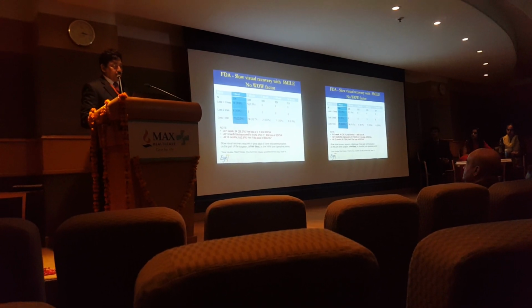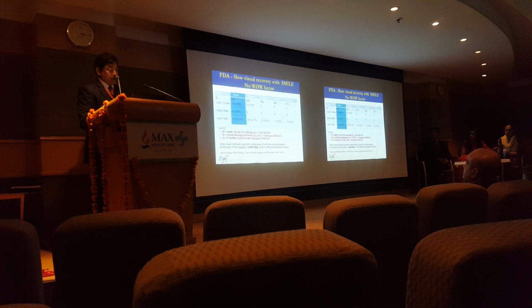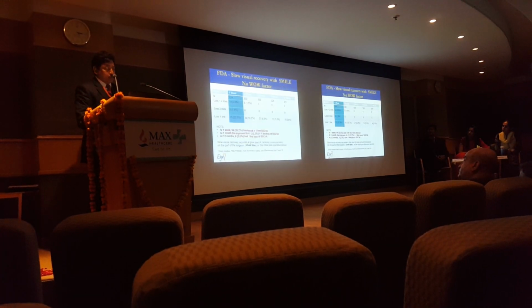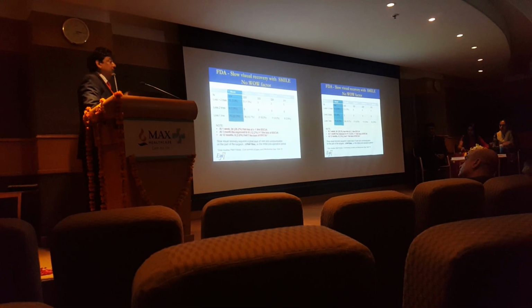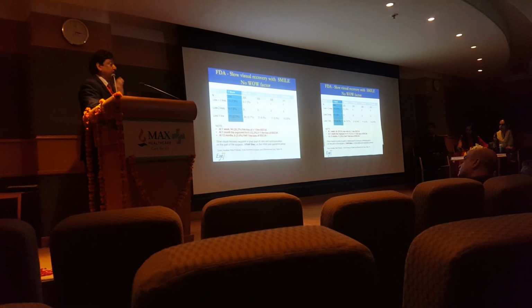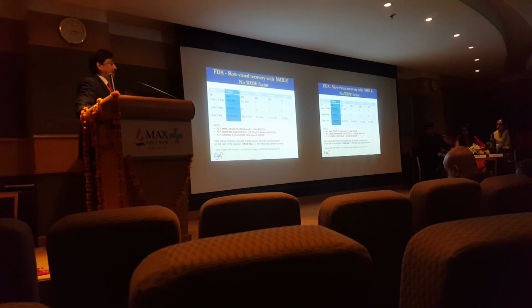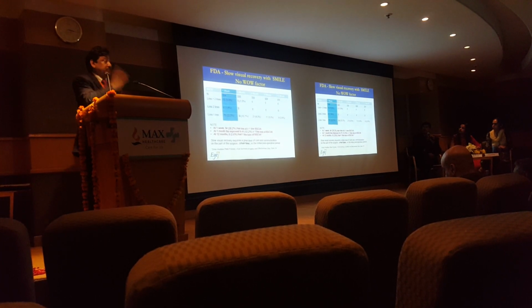So if you look at this 1 week data of 334 patients, this data says at 1 week, 94 people, 28%, mind you, 28% had a loss of one or more lines of best corrected spectacle visual acuity. That means even with glasses, 28% could not read the last line and the second last line.